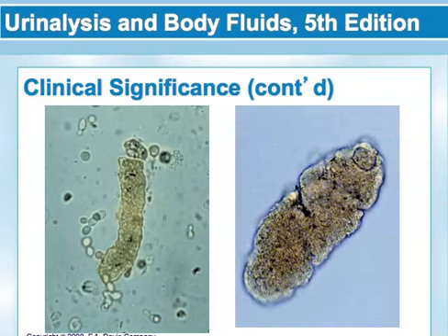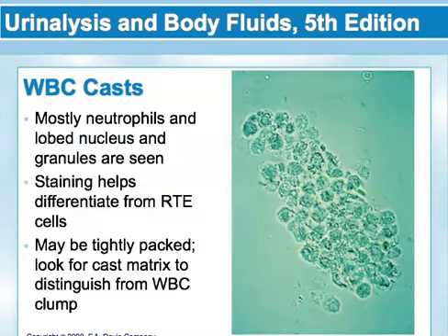And again, here are just some more variations on those casts. Okay, talking about white cell casts. White cell casts indicate an infection or inflammation within the nephron.